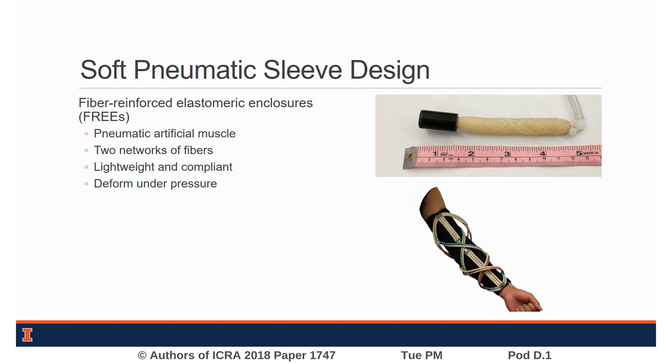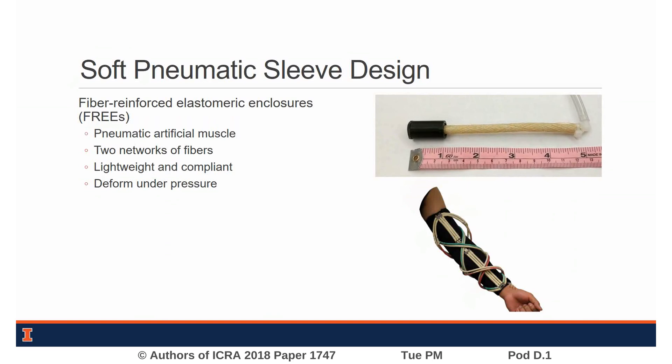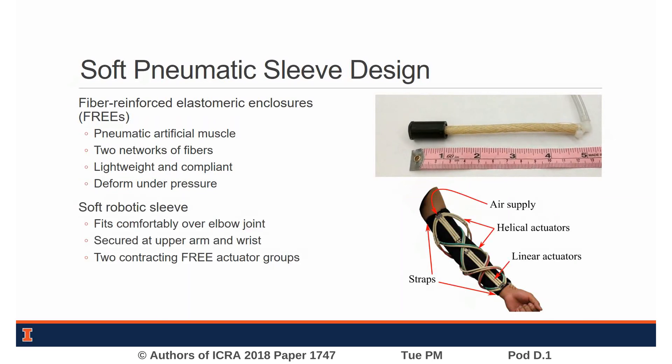FREEZ are a type of pneumatic artificial muscle that produce varied deformation when pressurized, determined by the orientation of fibers that are wrapped around their hollow elastic core. We have fitted our prototype exoskeleton sleeve with two groups of miniature FREEZ architectures, each of which provide greater actuation force and stiffness to the joint than a single FREEZ actuator.